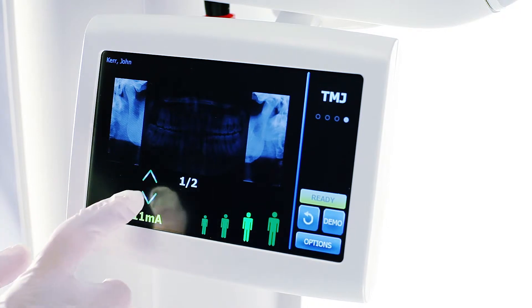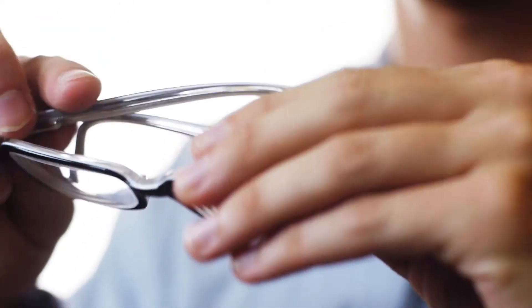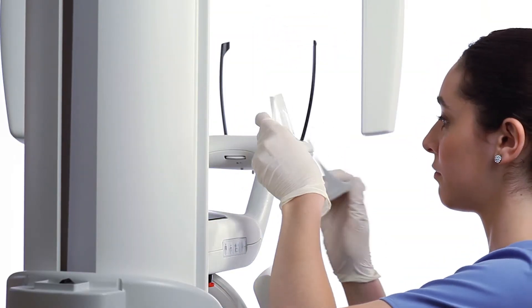Verify the technique according to patient size and anatomy. Explain the examination process to the patient. Ask the patient to remove glasses and jewelry. Place the sanitary barrier on the positioner.